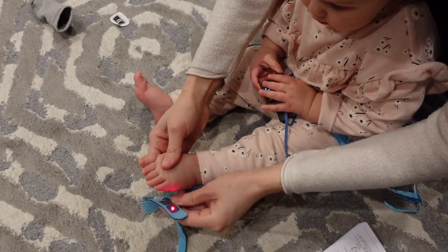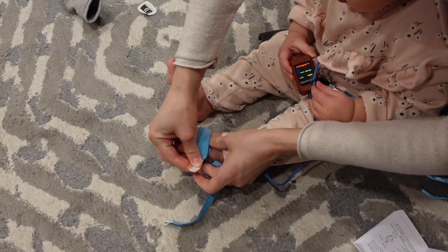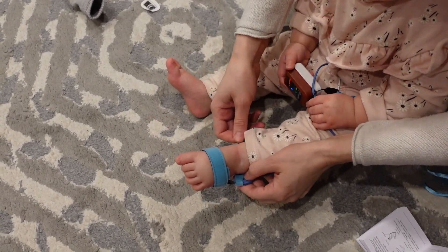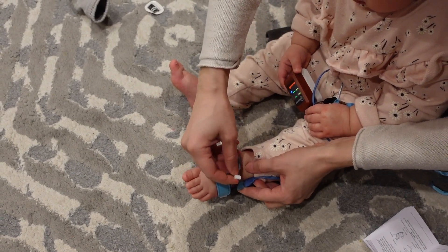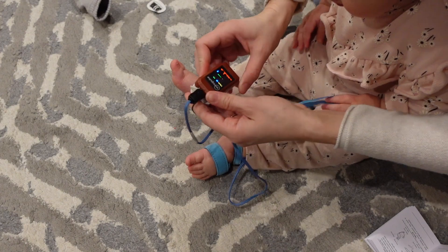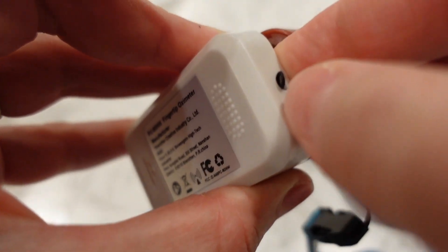Here is how I used it on my one-year-old baby. It can be tricky to get it on their feet when they are squirmy and trying to play, and it is important to note that you will not get a reading if they are moving. It has an adjustable strap that goes around their foot and ankle. The last thing included is a lanyard, which makes it easier to carry around.